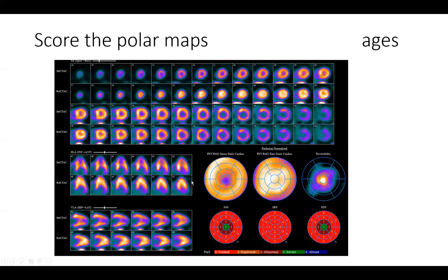We go to score these segments. Because of the improvement in the basal segments from rest to stress, we end up zeroing all the rest images and calling them normal. However, you can see on the reversibility map a significant perfusion defect in the apex and periapical segments, resulting in a sum difference score of 11 — meaning moderate ischemia or the extent of ischemia in the left ventricle.